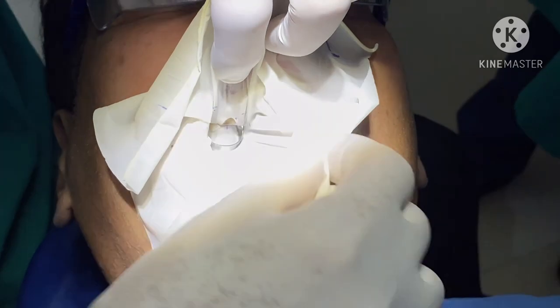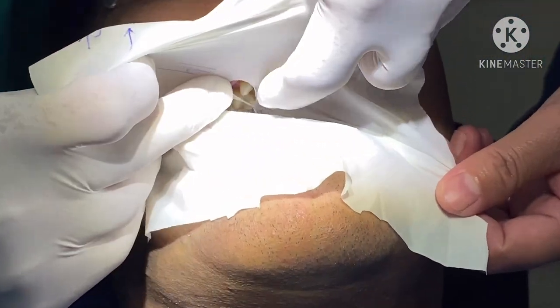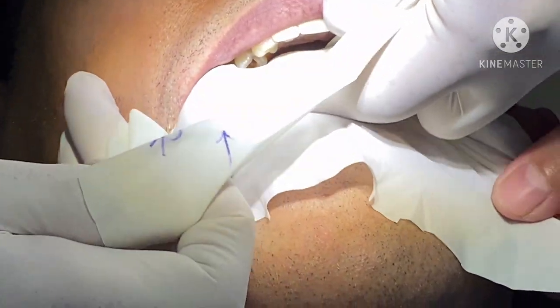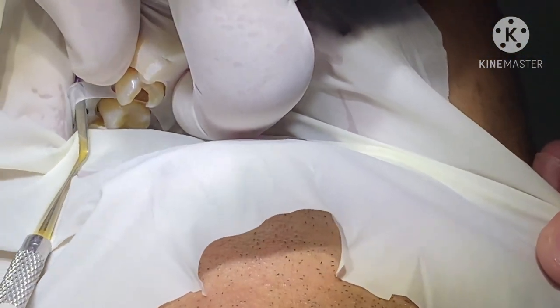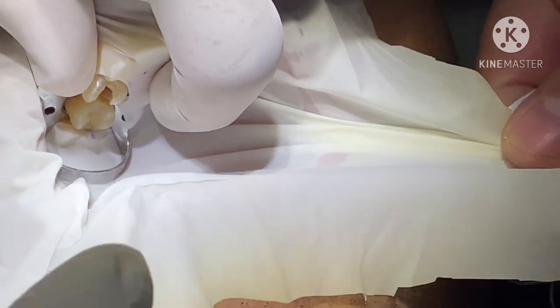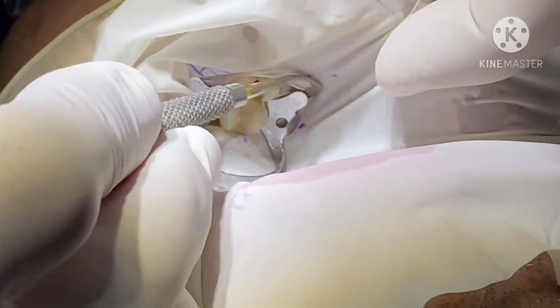Just hold and bring the stretch of the rubber on the between the interdental space. Then we stretch it over it. Similarly, on the palatal side, we see the space and then stretch it over it.